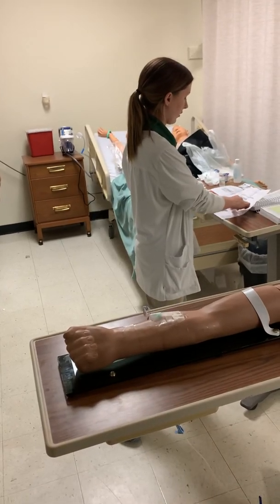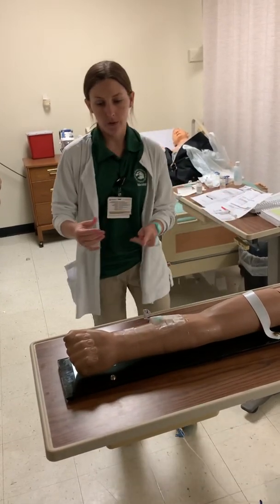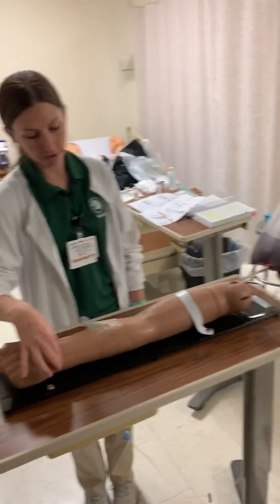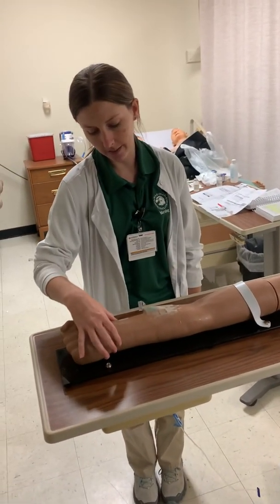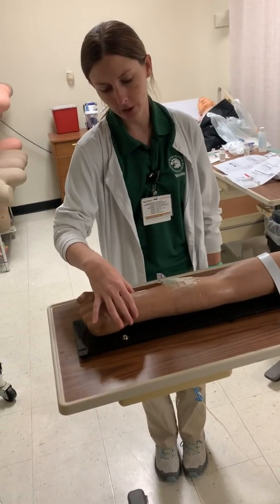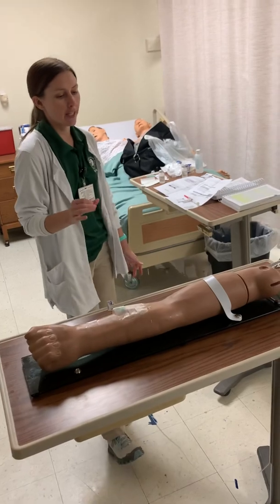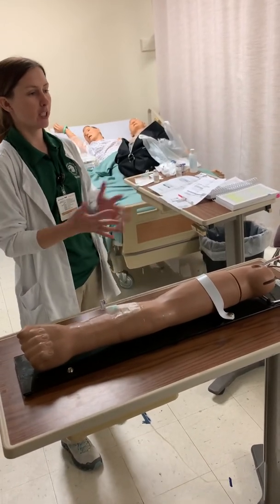I want to check their armband, and then I also want to ask their name and date of birth, introduce myself, make sure they know who I am, check their name and date of birth, make sure it is verified, and check their armband. The next thing I want to do is explain the procedure.